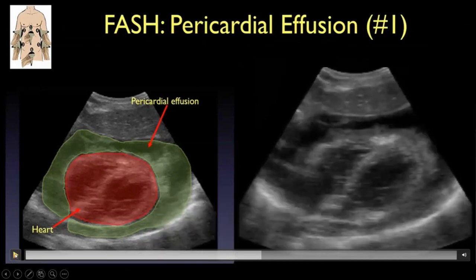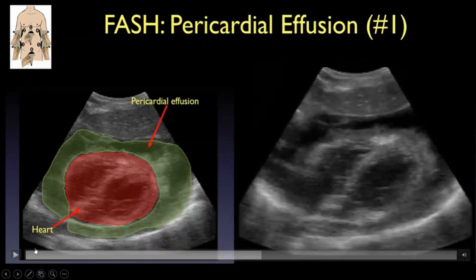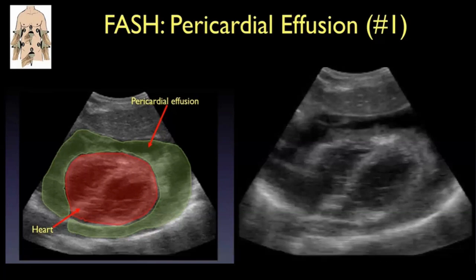Pericardiocentesis is not recommended in a hemodynamically stable patient, but in an unstable patient, where we're thinking of tamponade, we can definitely consider doing a pericardiocentesis as life-saving. The pericardial fluid itself is often straw-colored. However, if we're thinking of bacterial superinfection, it can be more putrid. And if it's more blood-stained, we can think of things like Kaposi's and malignancy.